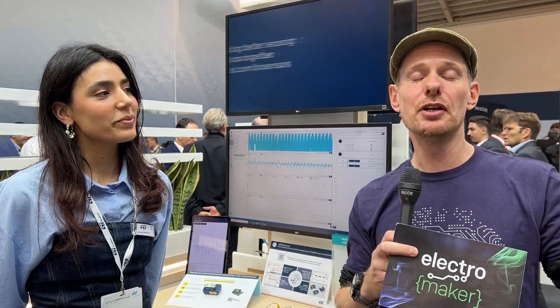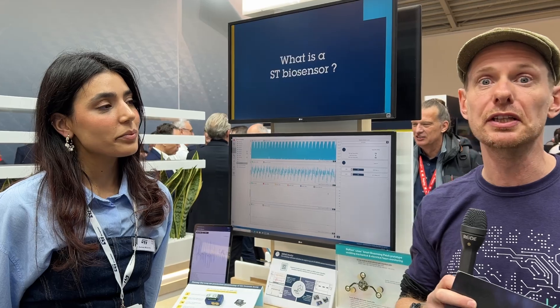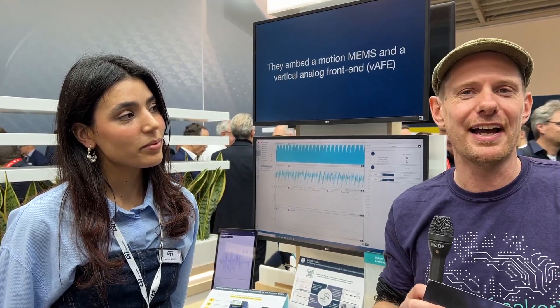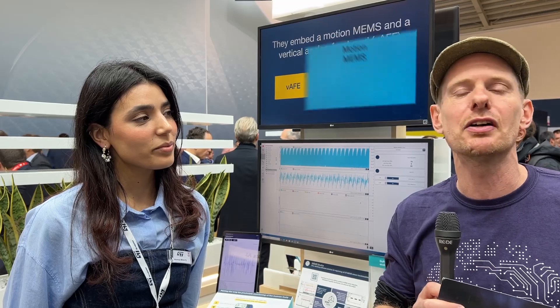Here at Electronica 2024 in Munich, we're at the ST Microelectronics stand talking about biosensors. When it comes to sensing things, you need to sense an analog signal and get that into your system. If you want smooth readings, you'll probably want to do some kind of smoothing on it. This adds up very quickly, but sometimes things come along that do all of that in one very small package. I'm joined by Asma, who's going to take me through their biosensing demo and why this might be an easy way to get started with wearables or things that work in the medical industry.